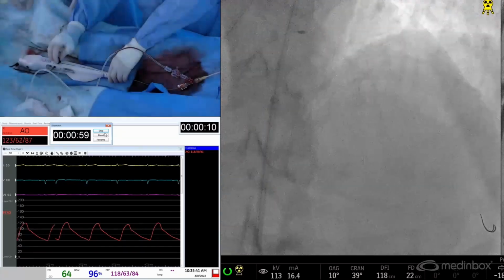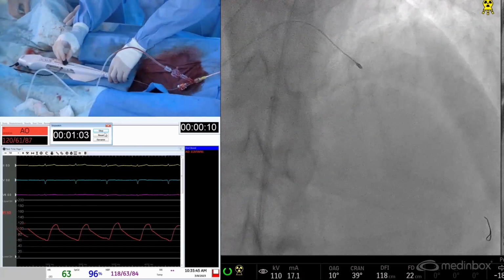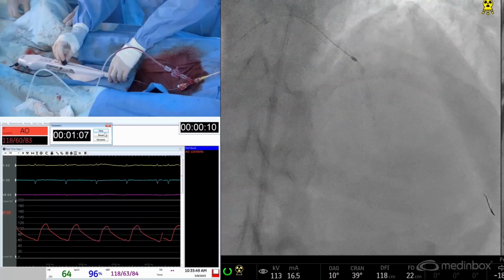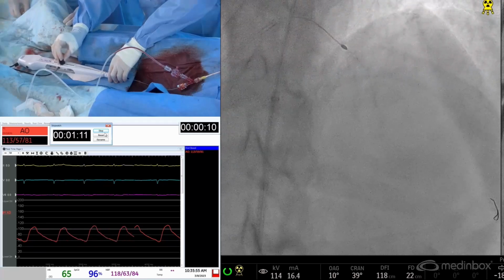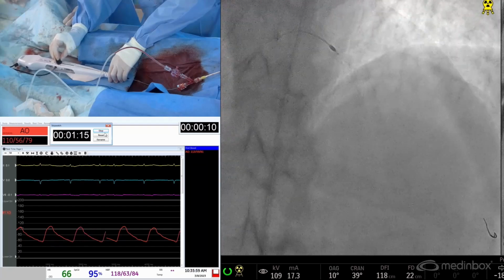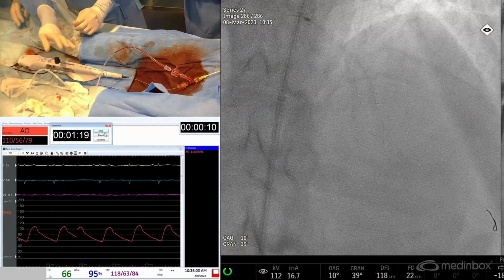Maybe do another run proximally, and then also there, where there's noises. So we're discussing where to ablate. We're going to do three runs, giving time.